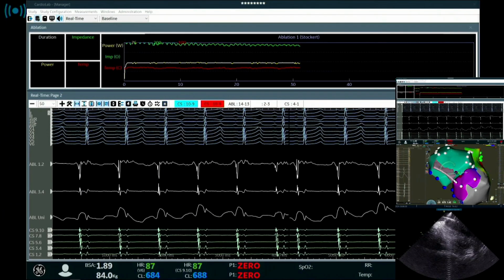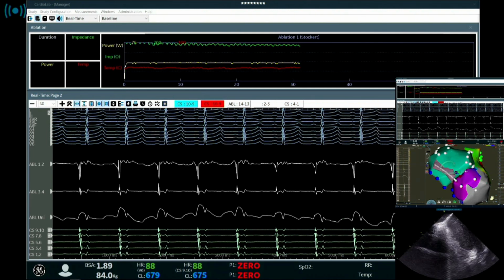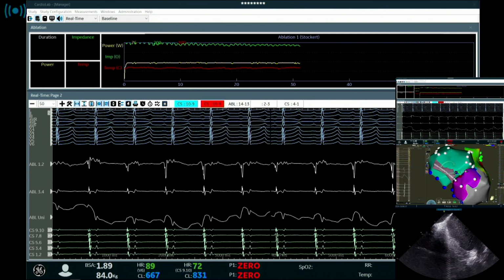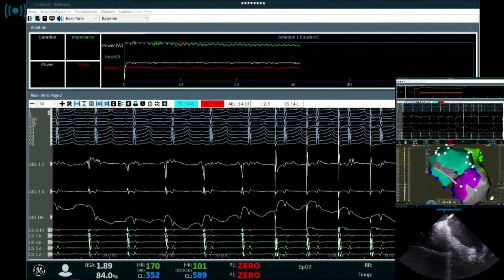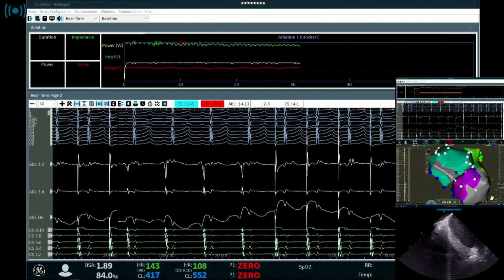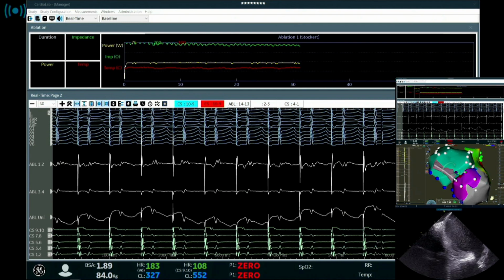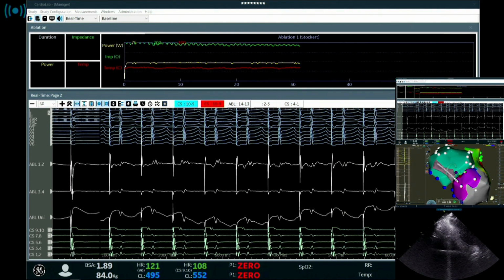This is probably very difficult to display with imaging, ganglionic plexi, but some people believe that if you have some fragmentation in some areas, you can do even high frequency, or you can do spectral analysis of these high frequency potentials. So it can give you some so-called AF nests. That's an invention of Dr. Pachon, who also invented neuroablation, or described first neuroablation. So everybody does it in a different way at the end.